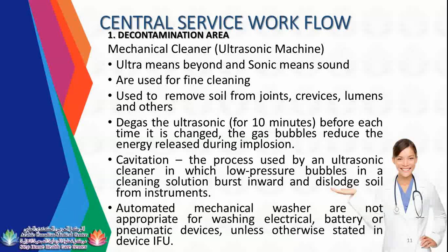In this area, cavitation is the process used by an ultrasonic cleaner in which low pressure bubbles in a cleaning solution burst inward and dislodge soil from instruments. Cavitation is the term they use once the low pressure bubbles from the ultrasonic machine dislodge the soil from the instruments.